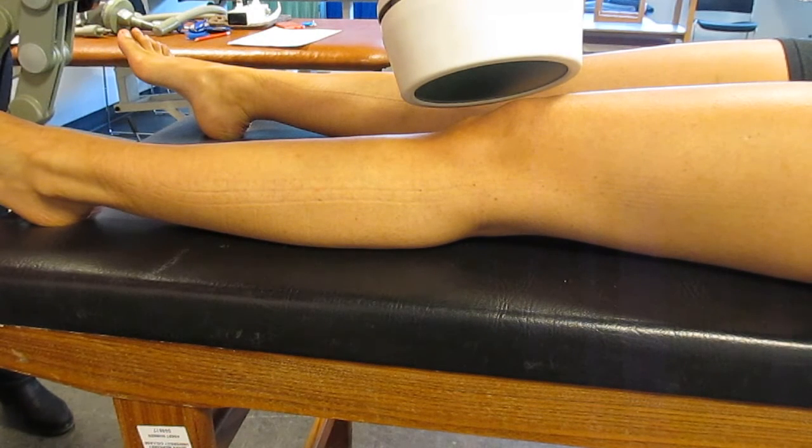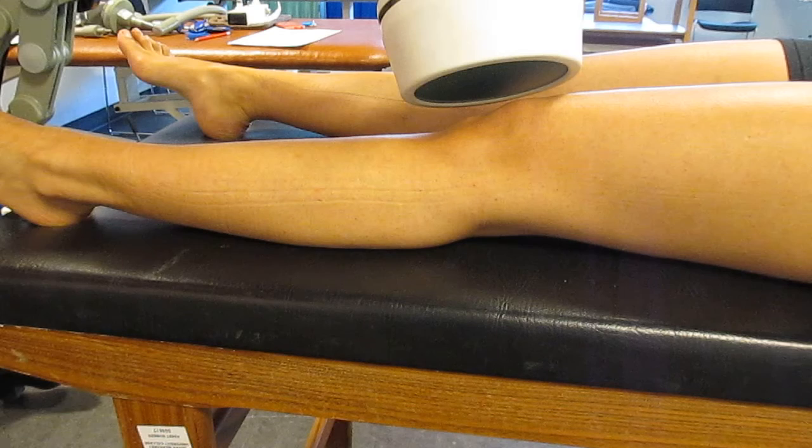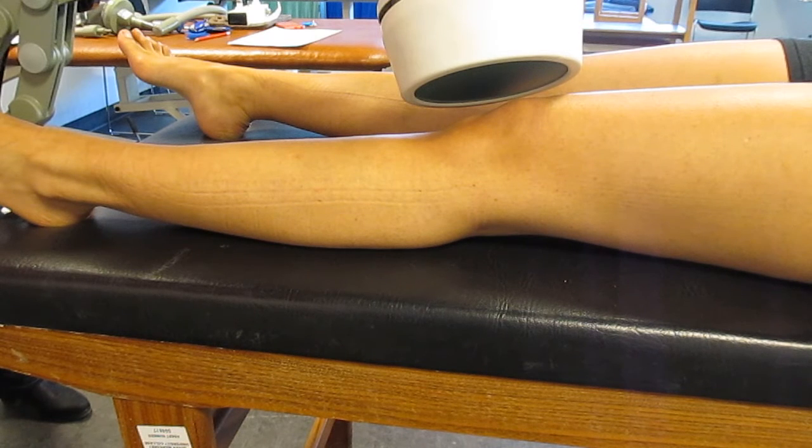I'm going to switch my machine on. I'm going to turn the pulse repetition rate to 35. I'm going to turn my timer up to 10 minutes, and then I'm going to turn my peak pulse power to 20%, which is number 2 on the Cura Pulse 419 machine.